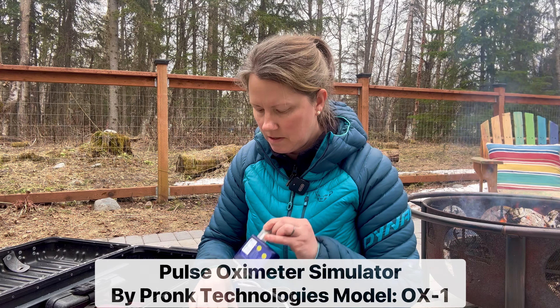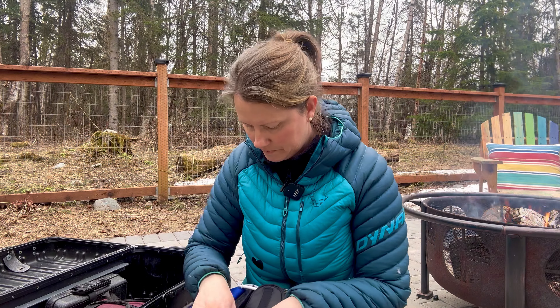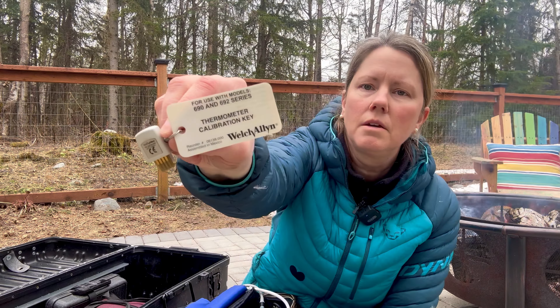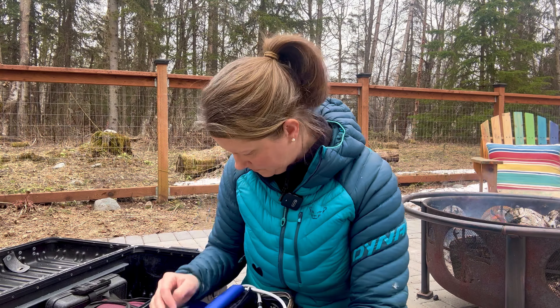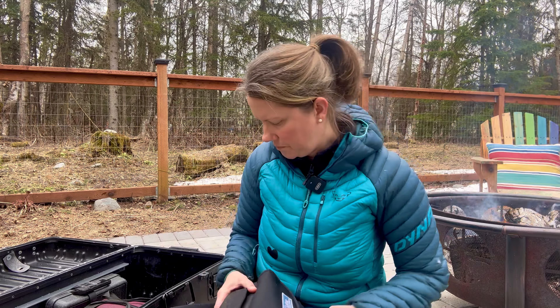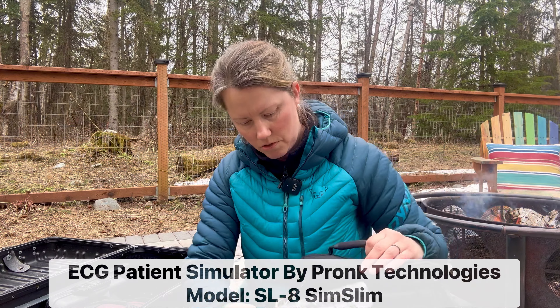I have my little SpO2 and pulse ox. I also carry different calibration keys for different types of thermometers — I've got a few different ones. This device is also used for testing ECG on vital sign monitors.